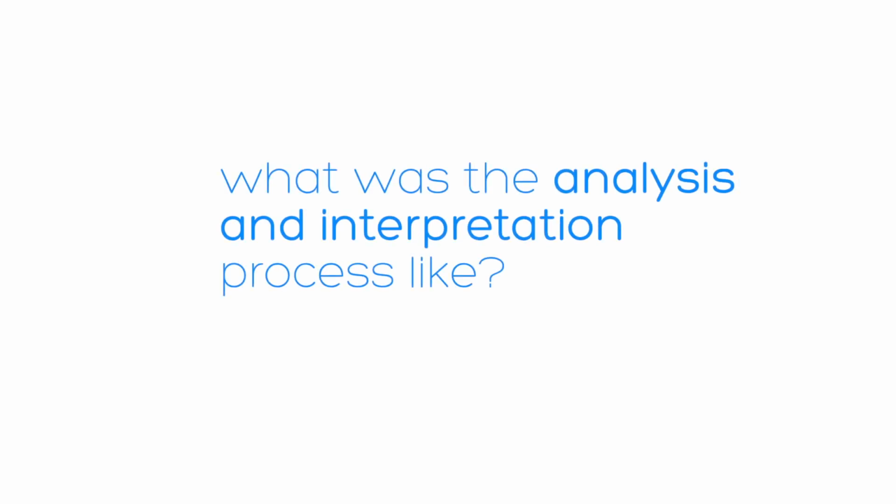The microarray we use is a SNP-based array from Illumina that provides whole genome coverage. So once the sample is processed and the microarray is run, the data is captured by NxClinical. And what NxClinical does is some processing and provides us a genome-wide view of all the data points across the genome for the SNPs. So that allows us to look at two very important elements that the microarray SNP data generates. And that is copy number variation, whether there are large or small segmental deletions and duplications. And additionally allows us to look at the genotype data across the genome, because it's a whole genome SNP platform.